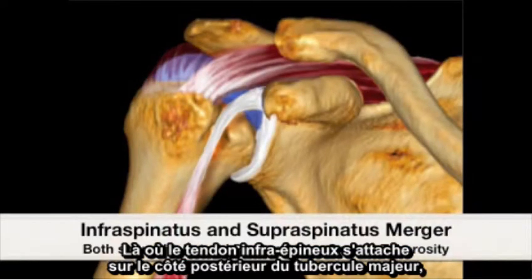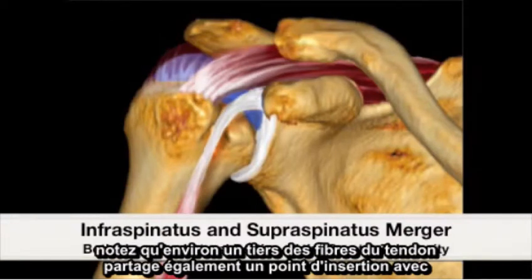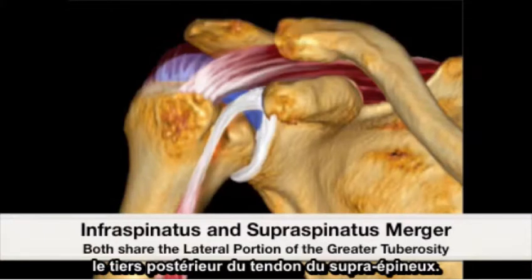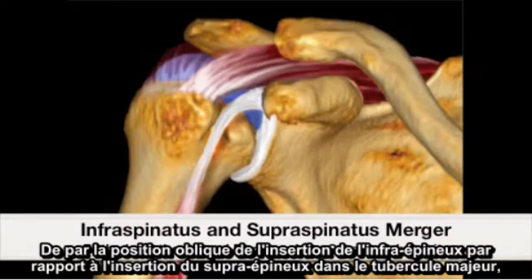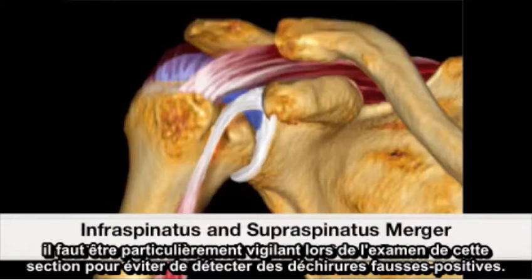As the infraspinatus tendon attaches to the posterior aspect of the greater tuberosity, take note that about one-third of its tendon fibers share an insertion point with the supraspinatus's posterior one-third as well. Due to the oblique nature of the infraspinatus insertion relative to the supraspinatus insertion to the greater tuberosity, special care should be taken while scanning through this section to avoid false positive tears.